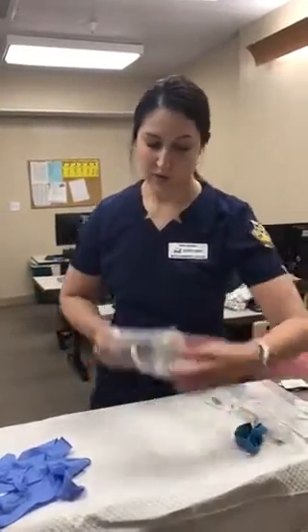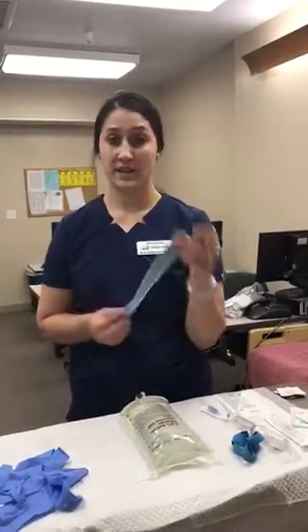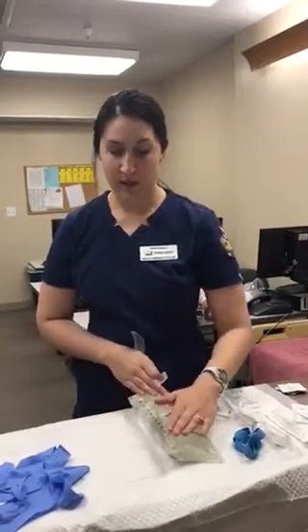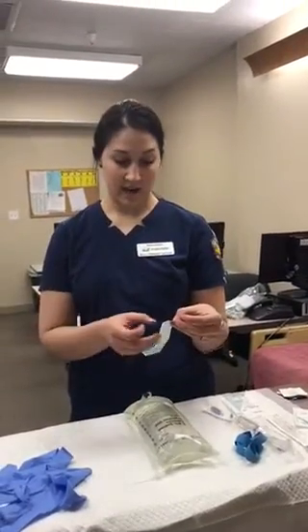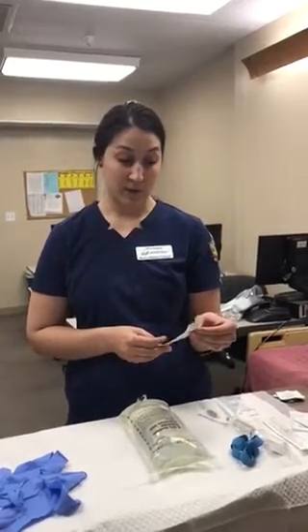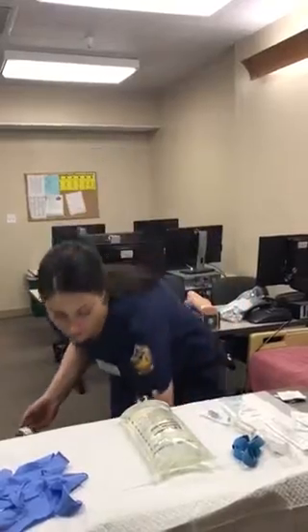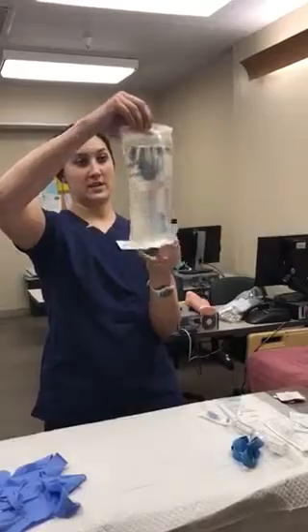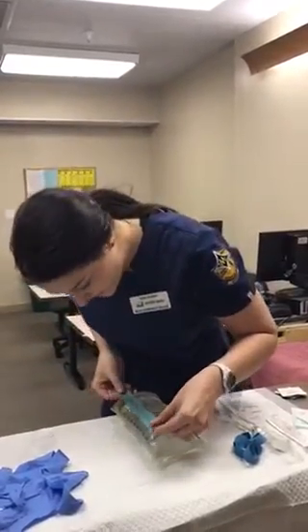The next one I'm going to apply that I've already pre-made is my infusion rate time strip. So this just gets applied to the bag. It helps you identify where you should be at each hour. Again, it has the date of today, the start time, the infusion rate of 125 mils per hour, and the drip rate as well, 21 per minute. I'm going to peel that off, just going to check and make sure where that starts. Go ahead and apply my strip.